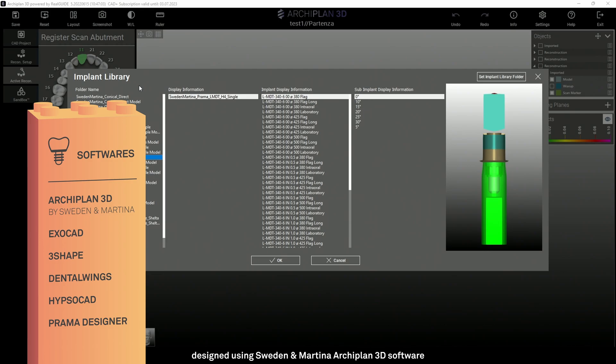Let's see an example of digital use of these components. I'm using Sweden & Martina's Archiplan software, but the libraries are also available in Exocad, 3Shape, Dental Wings, Ipsocad, and Prama Designer.